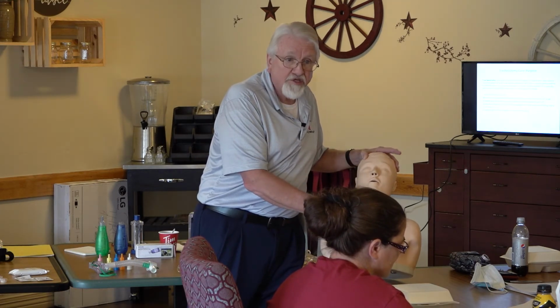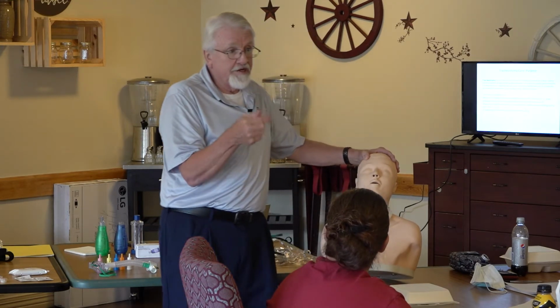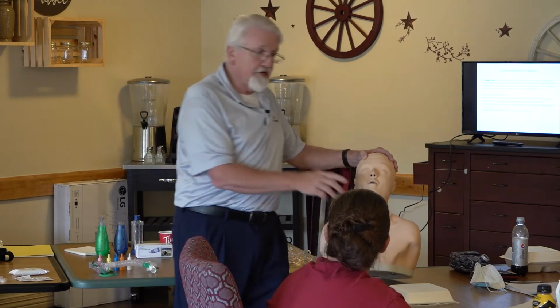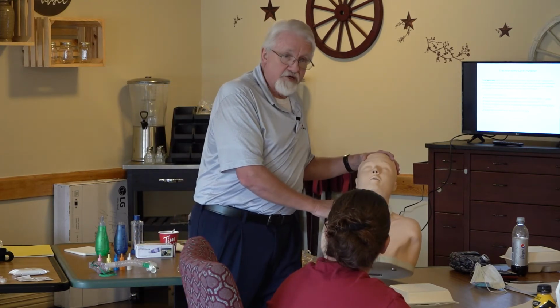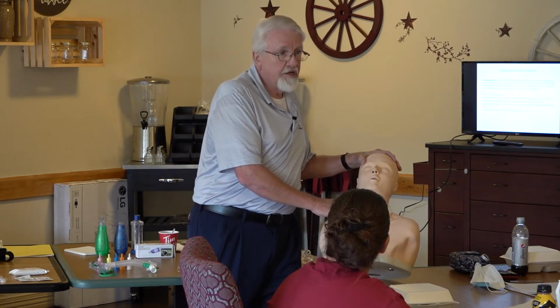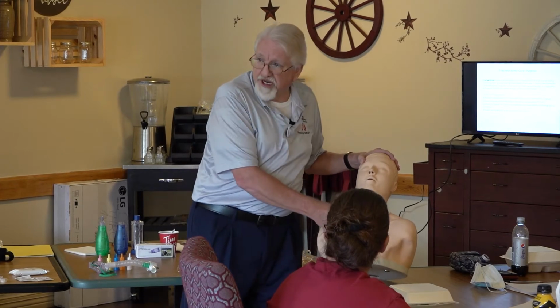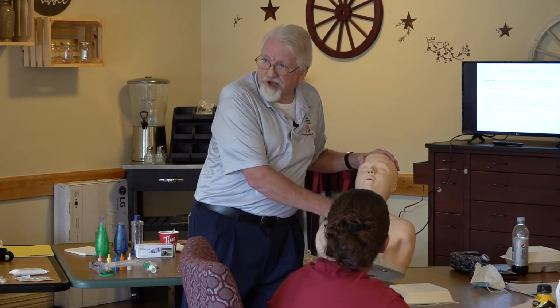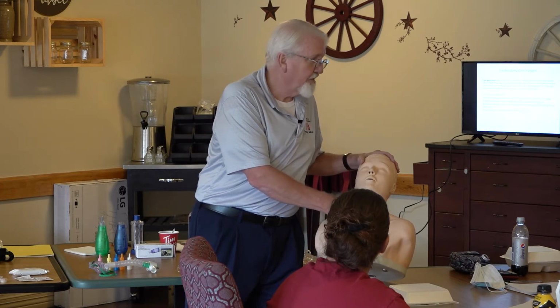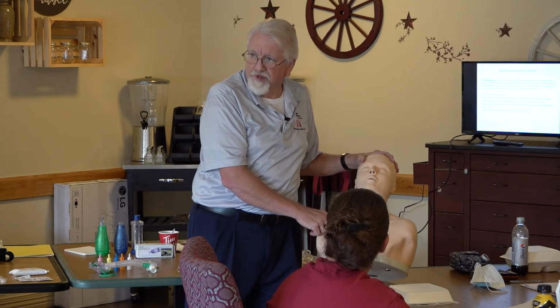If they're on oxygen, they may have difficulty breathing. They may not have difficulty breathing. I got a call from a facility one time where the trach had come out during the night, nurse so-and-so put it back in, but we can't get it sat up. So I went over there, and so what happened was what I just said. They had put it into a pocket, not into the airway. As soon as I was able to get it back into the airway, his oxygen level went right straight up. Okay.